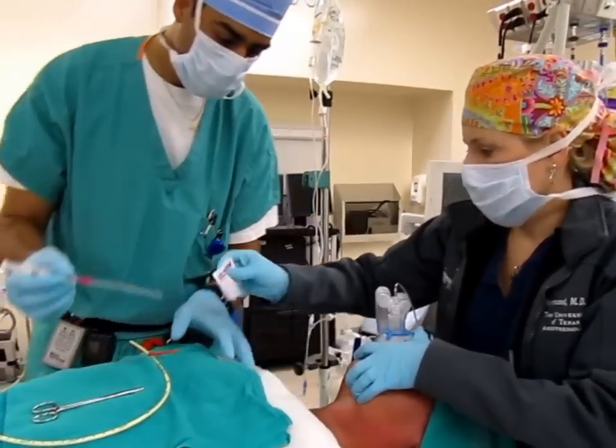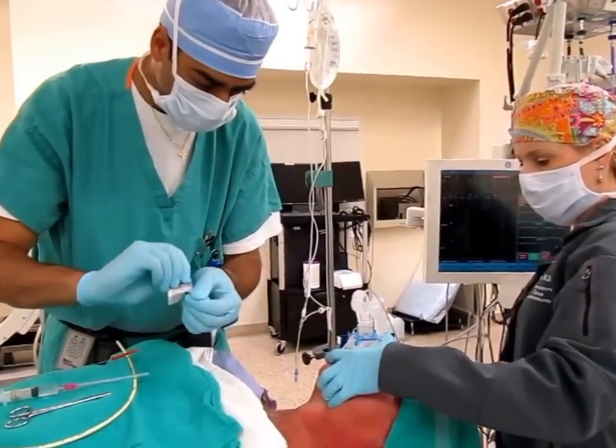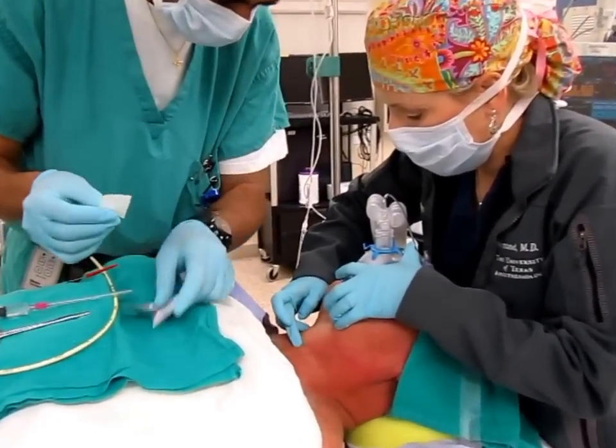This is your alcohol swab. Walk down from the thyroid — that's the laryngeal prominence — and you can feel it right there.